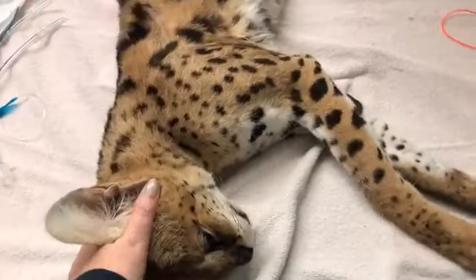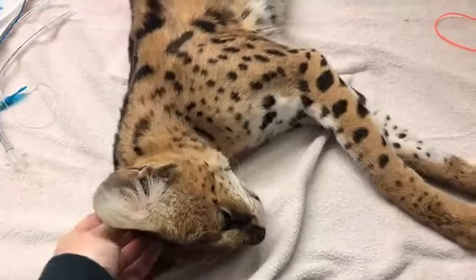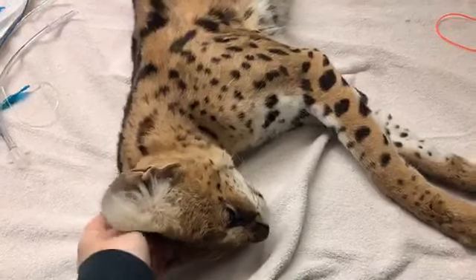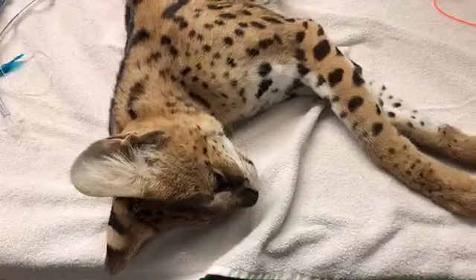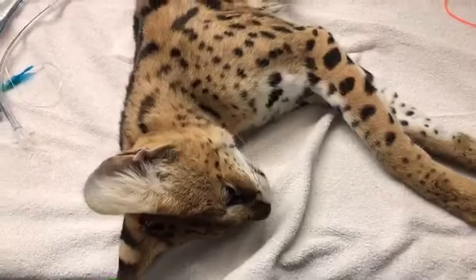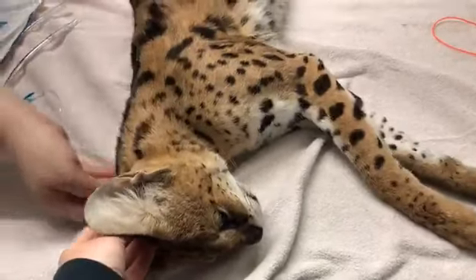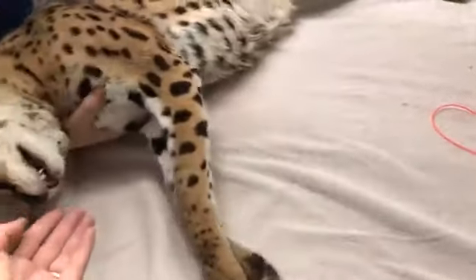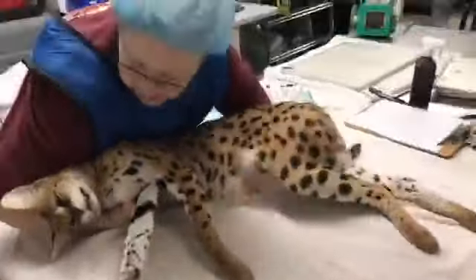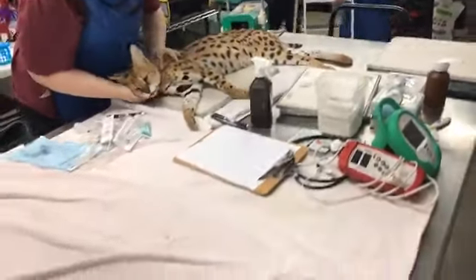In addition, part of our process, we can always move down the table too. Part of the process for intake exams is that we are going to... I can help too. You can shut me off if you need an extra hand. Would you like me to decrease the table so that it's lower for x-ray? No, that's all right. Okay. You can interrupt me anytime because the medical care is the first priority. You can see how lanky this girl is. And we're going to stand back for radiographs.